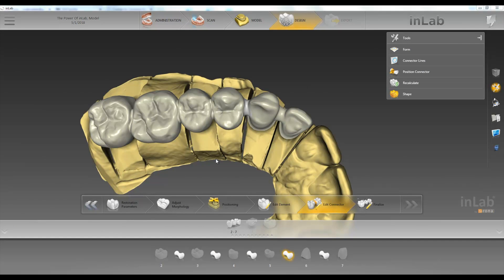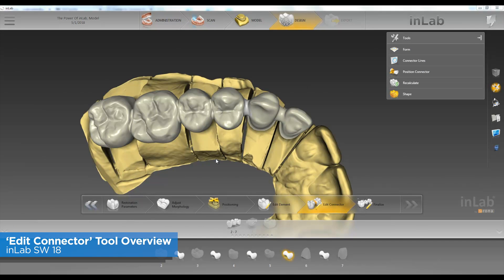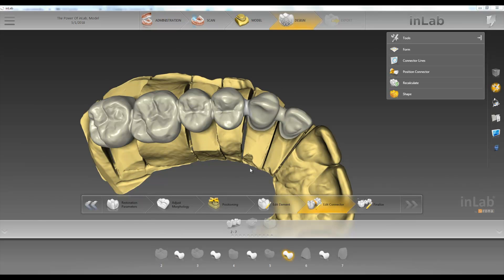Hello, this is Jay Black with Tekken 2. In this video we're going to go over the different tools that we have available to us in the edit connector step.